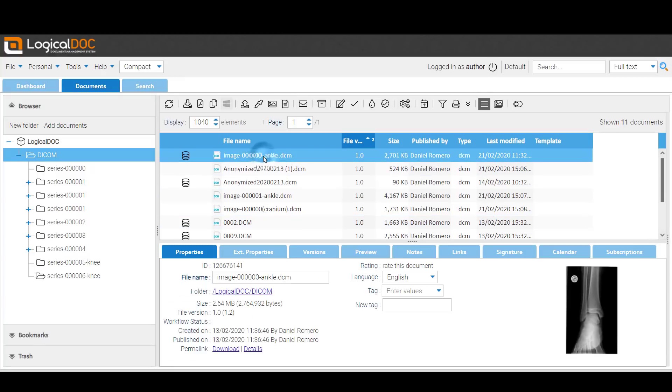Starting from LogicalDoc 8.3, the preview of medical files in DICOM format is available.